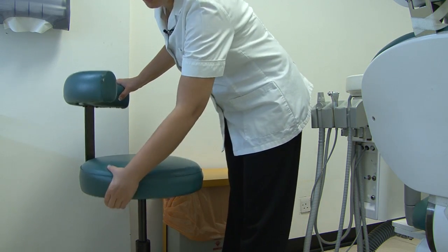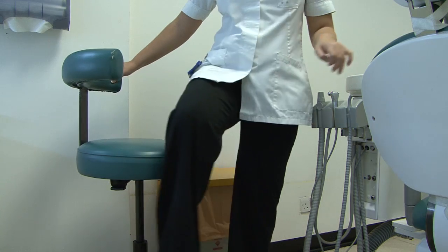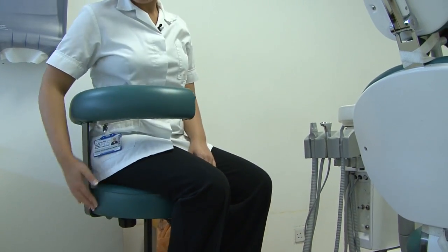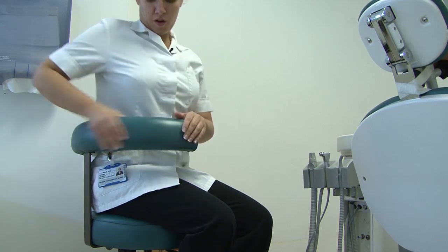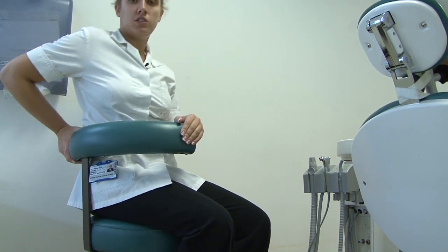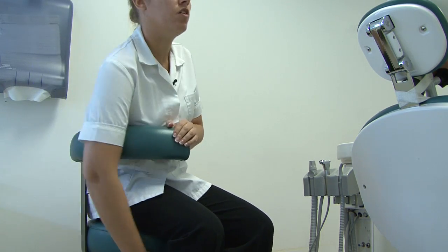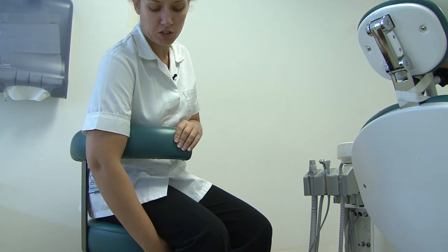The nurse's chairs are height-adjustable. You can tell which one is the nurse's chair by the middle bar around the base. I want my armrest to be around my waist so I can lean backwards, forwards and to the side without falling off. Then I want to adjust the height of the seat so my legs are at right angles.